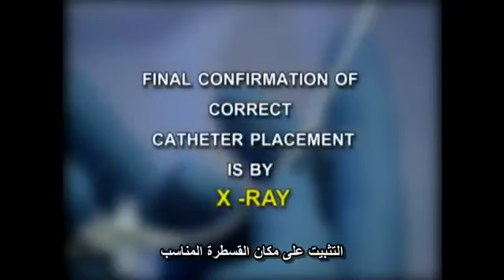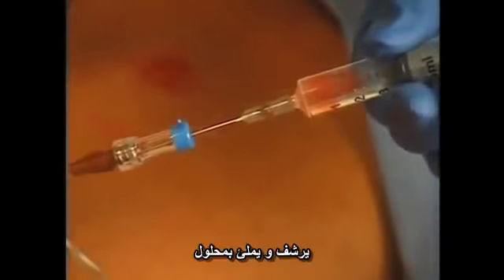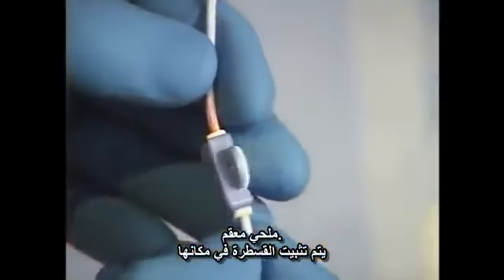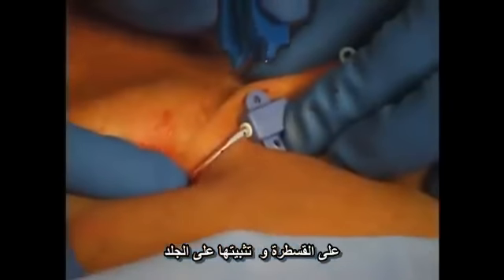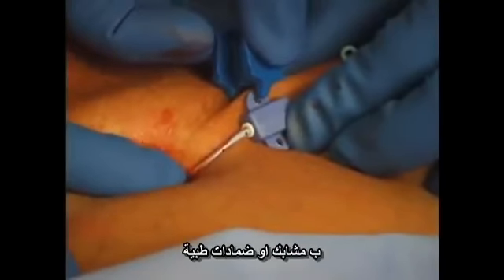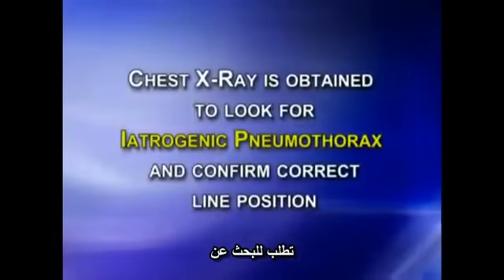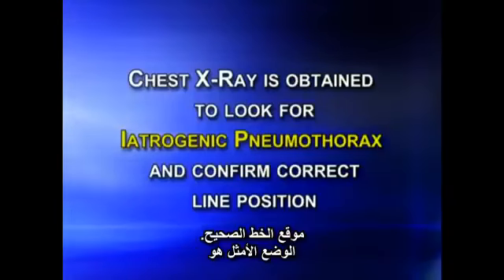Final confirmation of correct catheter placement is by X-ray. Each port is then aspirated and flushed with sterile saline. The catheter is secured in place by placing the catheter holder on the catheter and securing it to the skin with staples or sutures. A sterile dressing is then applied. A chest X-ray is obtained to look for an iatrogenic pneumothorax and confirm correct line position.